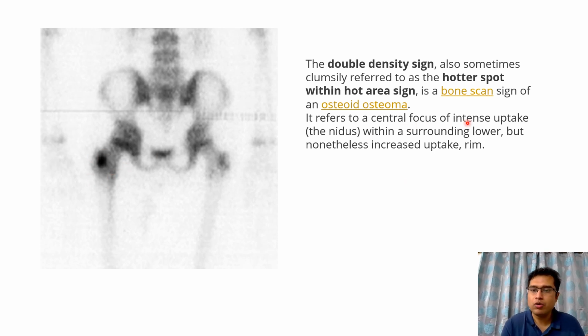So it refers to a central focus of increased uptake within a surrounding lower but nonetheless increased uptake rim.